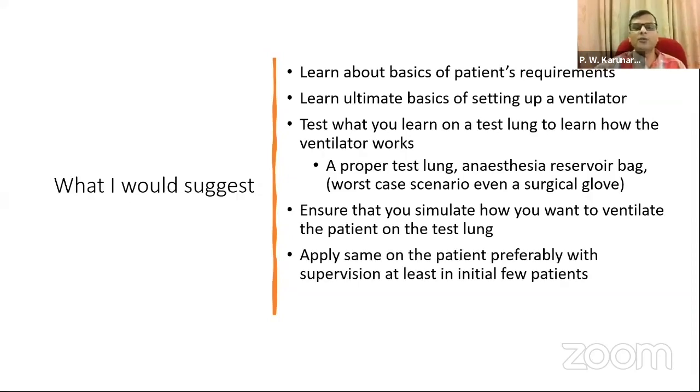And then you can apply the same thing, preferably, initially, with supervision, if you have it. That is the ideal situation. Somebody who knows, you can get help from an anesthetist or somebody who is familiar with this, so that you can get the initial help, and then whoever learns it in that unit or ward probably can help the other colleagues in managing. That is how it should go.